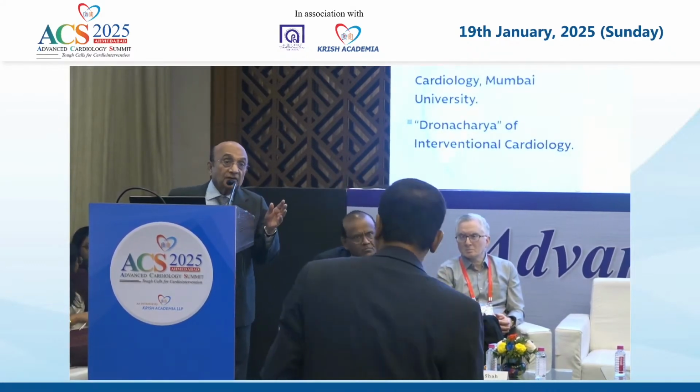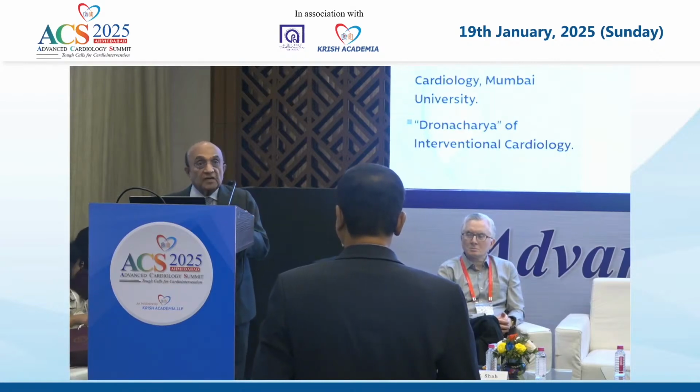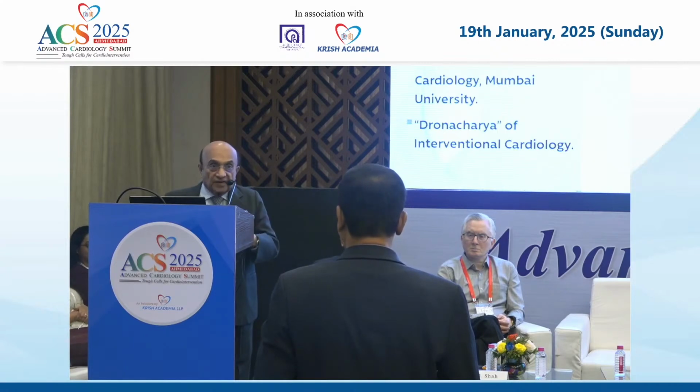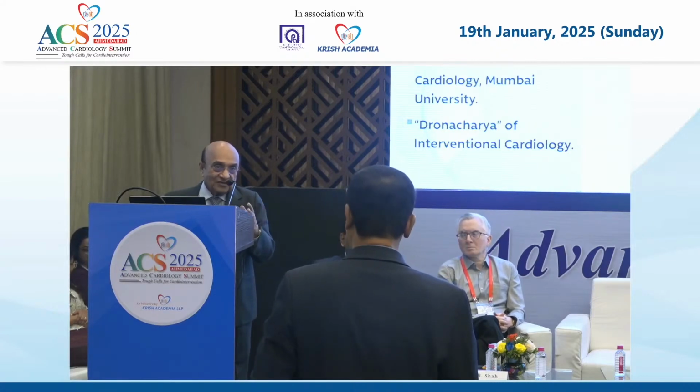Yes, compared to non-CTO lesions, CTO lesions have a higher restenosis in general. Rotablated lesions also have higher restenosis no matter what you use. But in Andreas Gruntzig's words, restenosis is not a complication, it's a sequela. Many operations are done twice. Hernias are done twice. Varices are done many times. Cataract is also sometimes done again after cataract surgery. So he thinks that as long as the patient is available to you for further treatment without any damage, it should not be hated. What do you prefer? Two sticks in the groin or one large six-inch incision on the chest? That the patient has to decide.